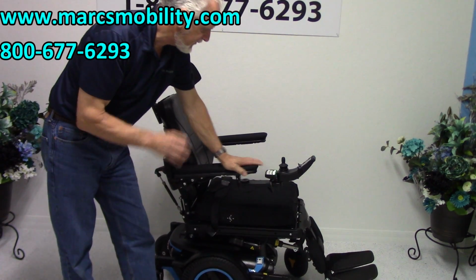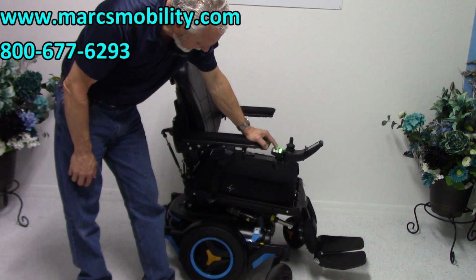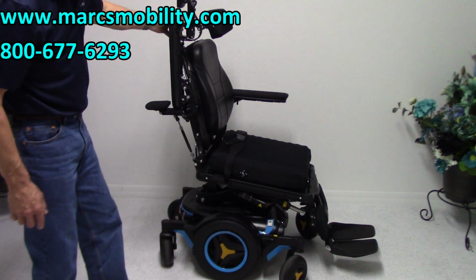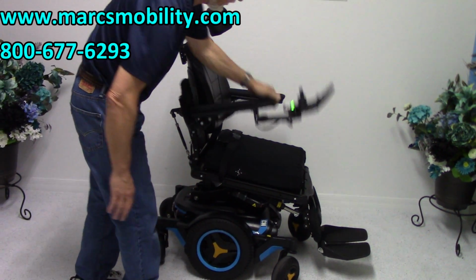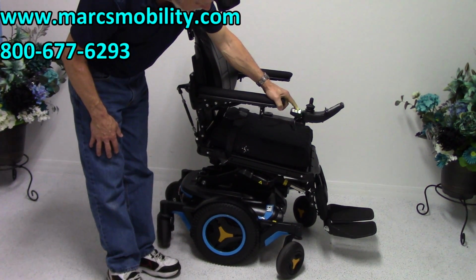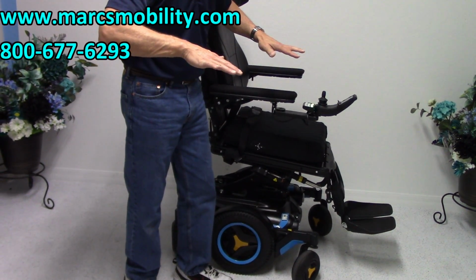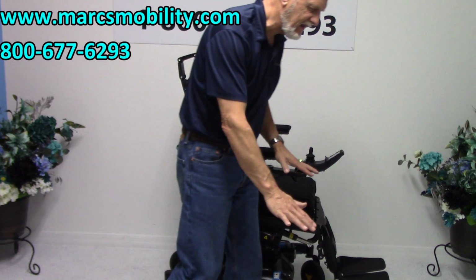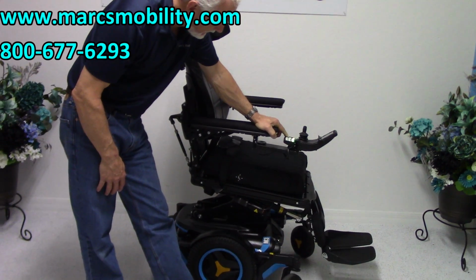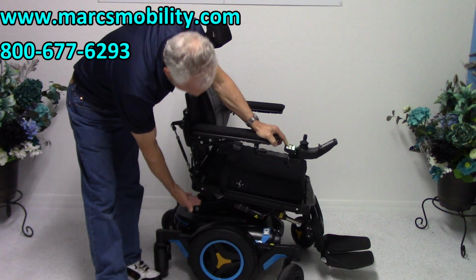Okay. So the next feature I'm going to show you is called the anterior tilt, and you'll see there's your anterior tilt right there. So this is the anterior tilt that I was talking about. You can see how it would help you get out. A lot of people will raise their seat up like this, higher. They'll bring the legs in, of course. So now they're sitting higher, they're tilted. It's easy for them to slide off the seat out of the chair. Okay? So I'm going to bring the seat back down, and I'm going to bring the anterior tilt back down to normal.